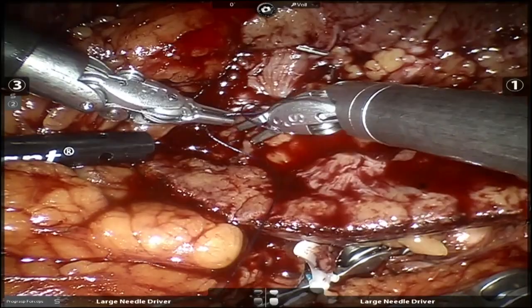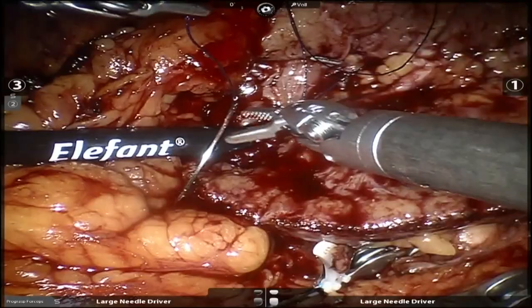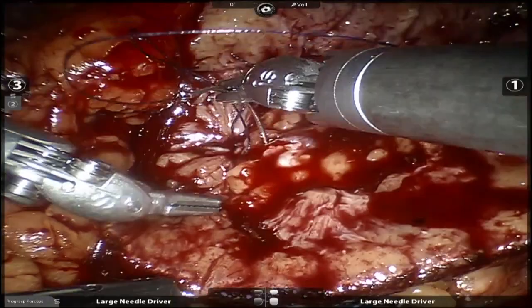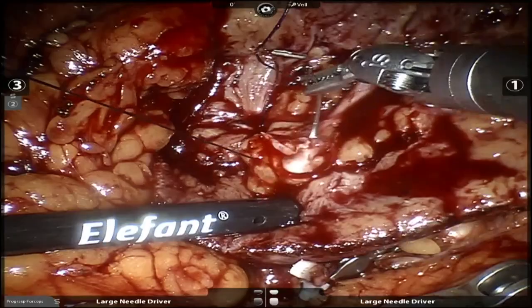Brandon, what are you doing? That's good. Suck there. Show me the calyx. There you go. That's good. Just a pulse. It's a little bigger needle than I usually use. I usually use the RB needle, but we'll use this today and be happy that we even have a needle.